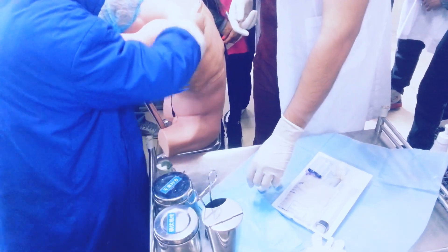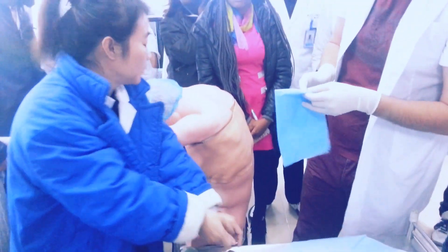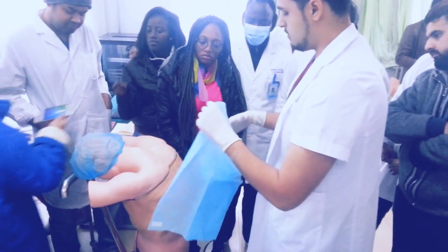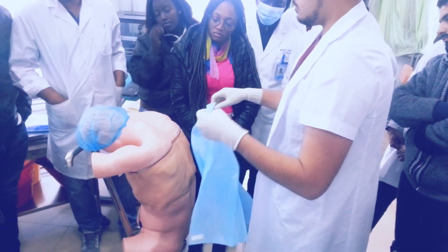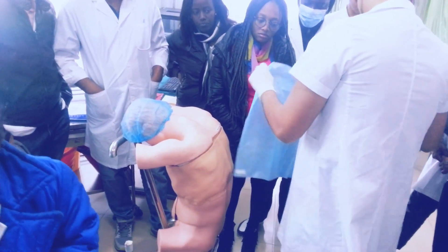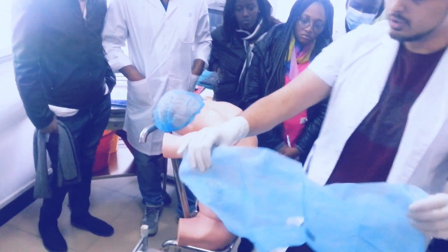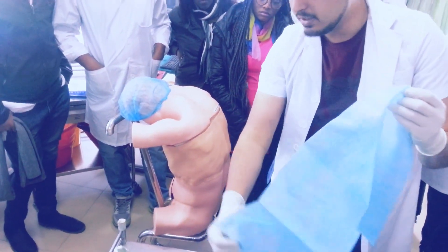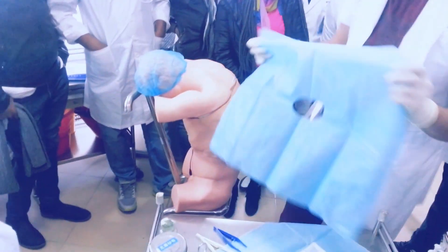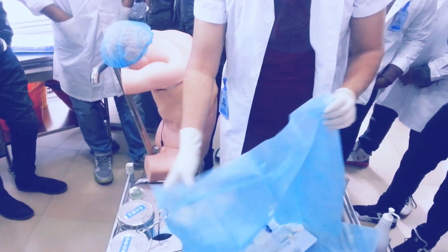If you apply this three times, after that you put it here. About the gloves — you cannot do it like this on the patient. You have to do it on the sterile area. This is the sterile area. Whenever you are picking this cloth up, you have to do so on the sterile area. You cannot do it on the patient. Like this is the sterile area — I will do it from here.